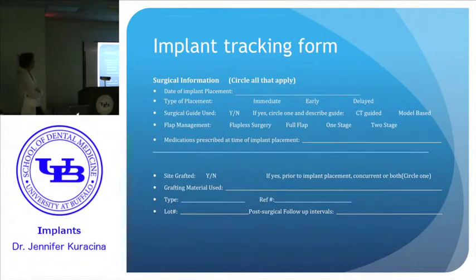And then there's a place where the surgeon or the resident is going to fill in the particulars of the procedure itself: the date, the circumstances, if it was immediate placement or early delayed, whether a surgical guide was used, what kind of flap management there was, medications that were prescribed, whether there's a graft, and if so, again, documenting the material that was used.